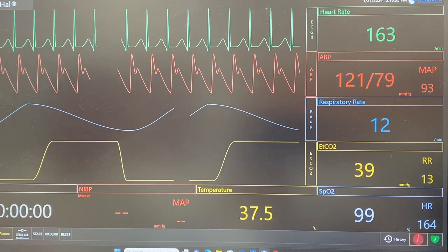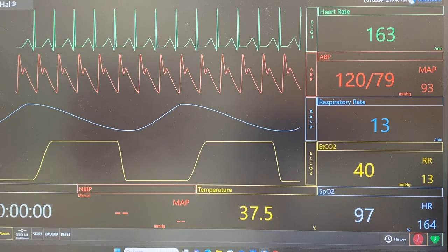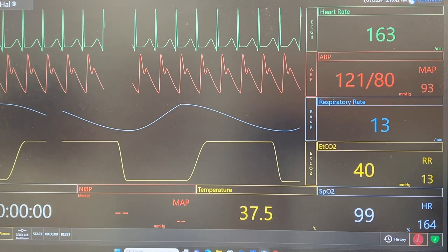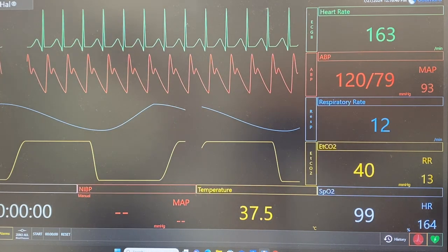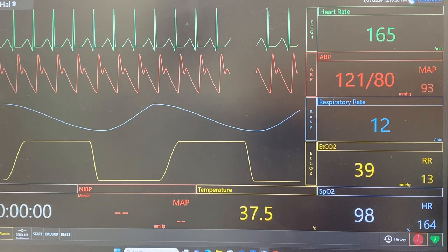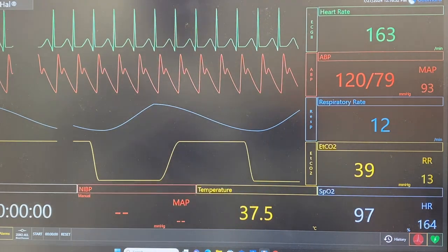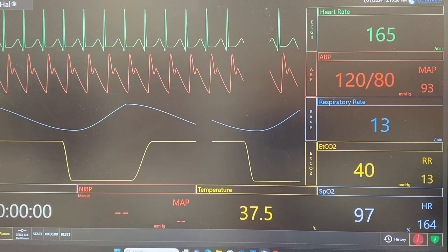All right, let's switch seats. Let's try Ami. You can do it. We'll walk you through it. Have a seat. Jessica's gonna teach you. Okay, this will be easy, I promise.